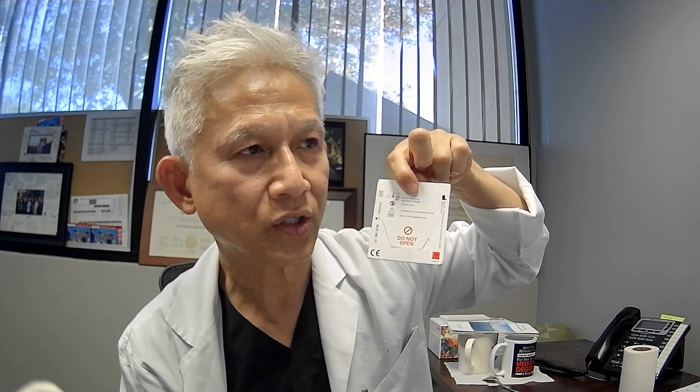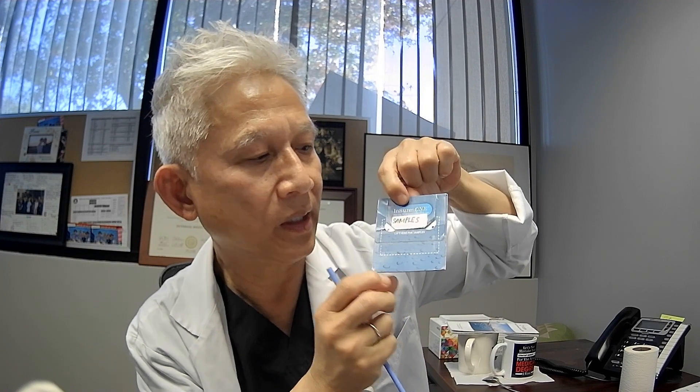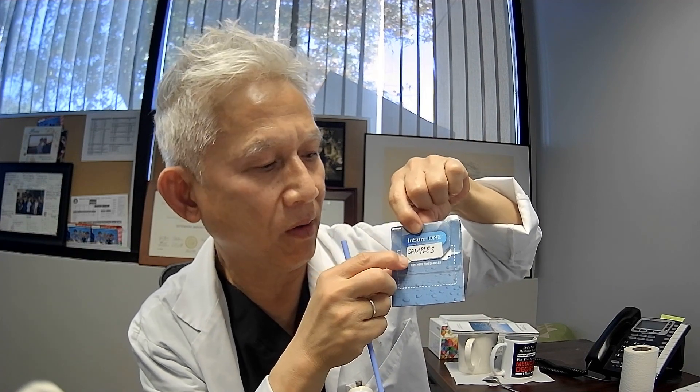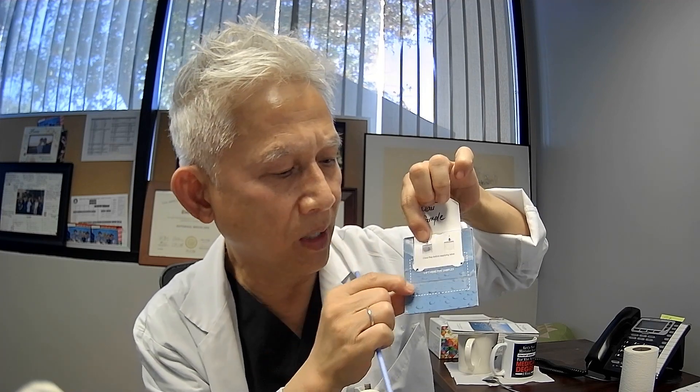This is the actual test here. Do not open here — do not open from the back. In the front, you open from here — two small white windows. You open it up. Do not open from the sides. If you open from there, you ruin the test. The test is not good anymore.